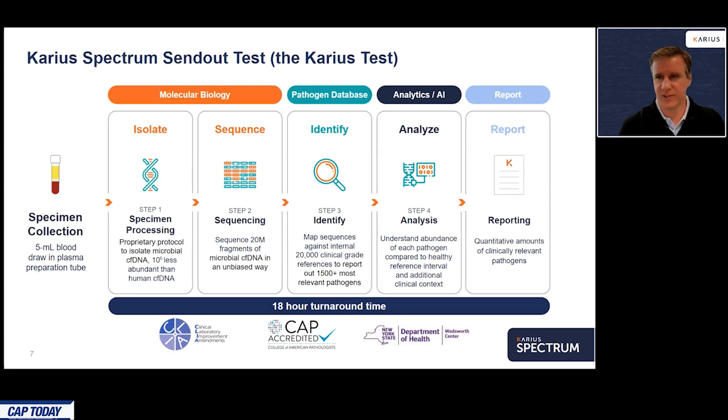The way this test works is it starts with a standard 5 ml collection of blood into ideally a plasma preparation tube.